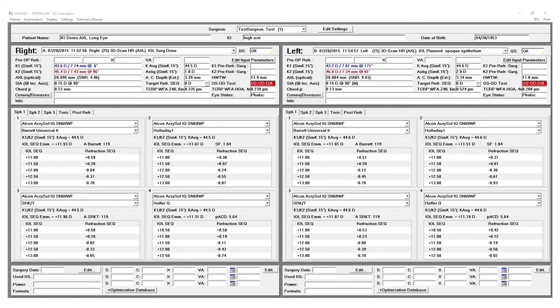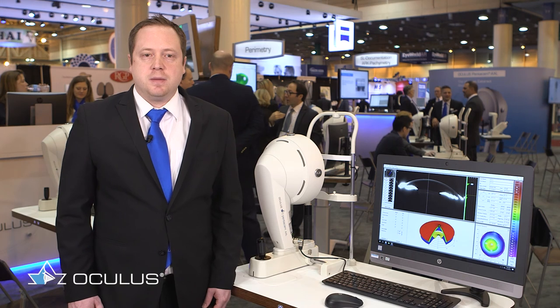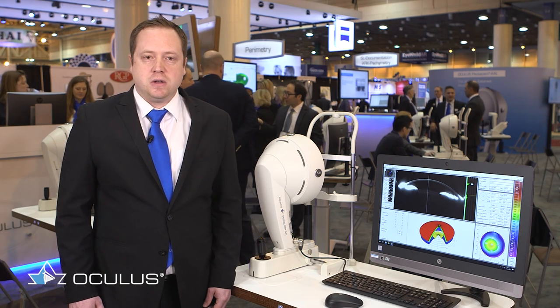We have also recently added the Barrett Universal 2 formula. For toric IOLs we have the Barrett toric calculator and we have recently implemented the Savini toric calculator which is designed to utilize total corneal refractive power.